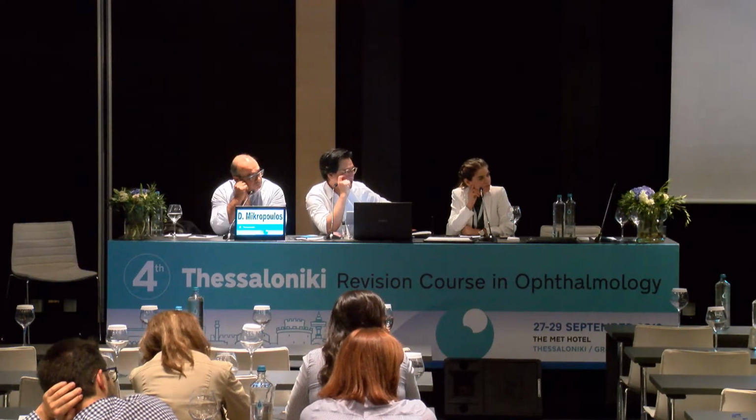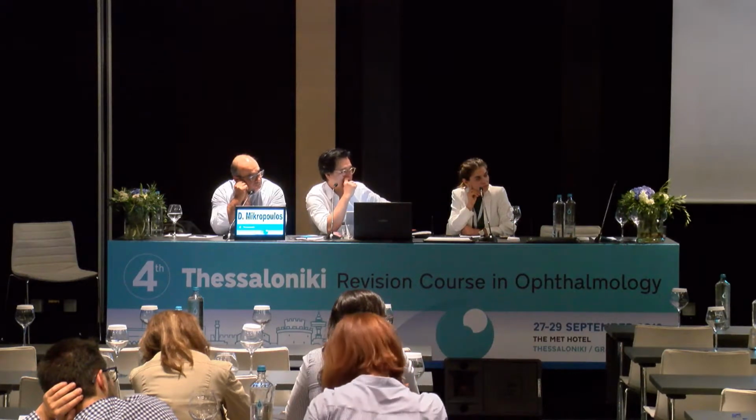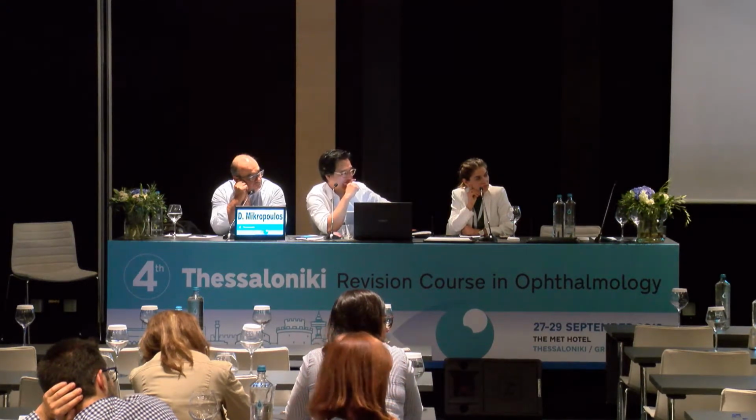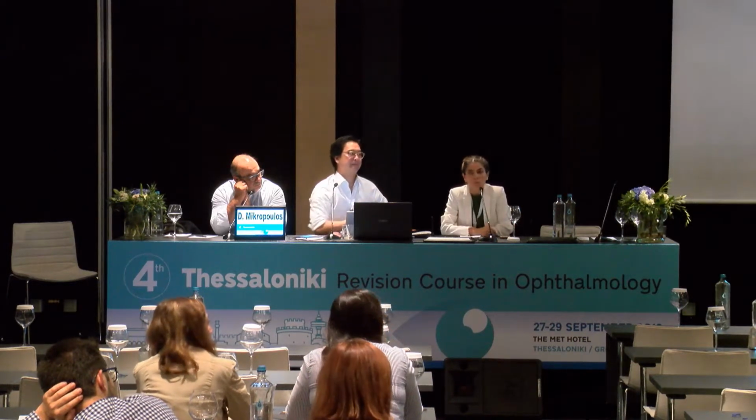to do not the standard visual field on Humphreys, but enhance, do a much brighter stimulus and much lower, slower pace so they can handle it a bit better and at least get a baseline from that with them, and then monitor it, of course, with the same protocol and see if you get. Would you do any of that?